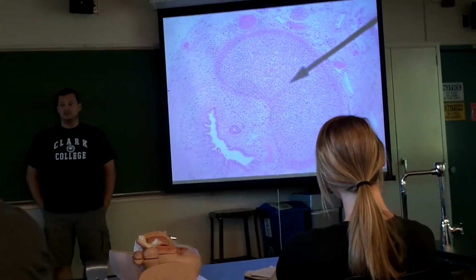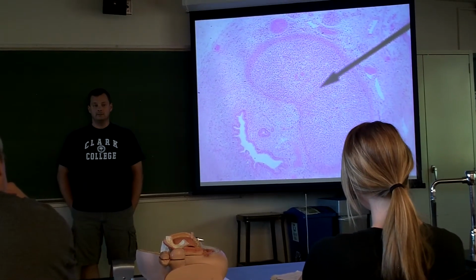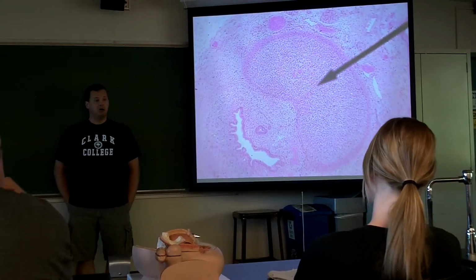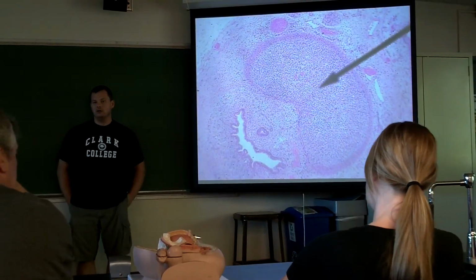All right, questions on penis slide? Okay, so again, for today, keep on with your studies of histology, and you can take a break and look at models at any point as well.